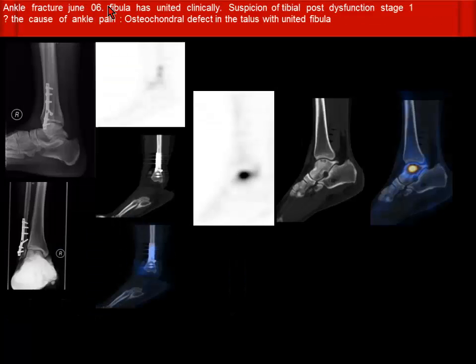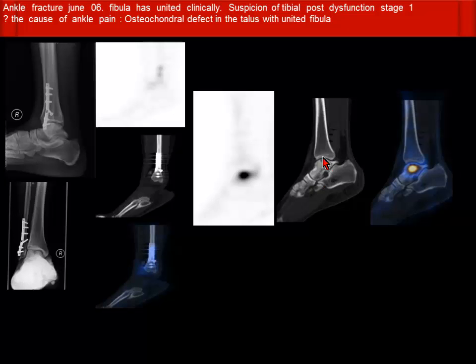Another patient with an ankle fracture — the fibula is clinically united but the patient had persistent pain. The question was whether there was malunion or nonunion at the surgical site. On the three-phase bone scan delayed images there was nothing — no significant increase in metabolic activity. But on the talus there are two lucency areas corresponding to increased uptake, which is a classical finding of osteochondral defects.